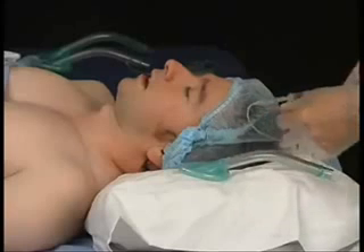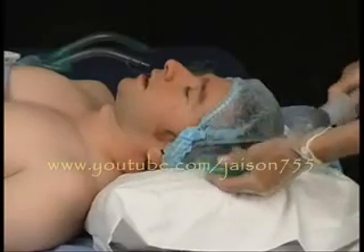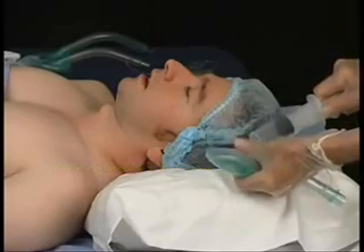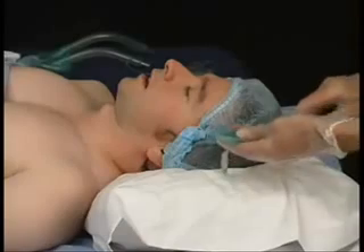Next, prepare the laryngeal mask airway by fully deflating it to a very tight vacuum, contrary to some popular belief that there should be some air in the cuff. This is not so because a filled cuff can collide with the epiglottis.